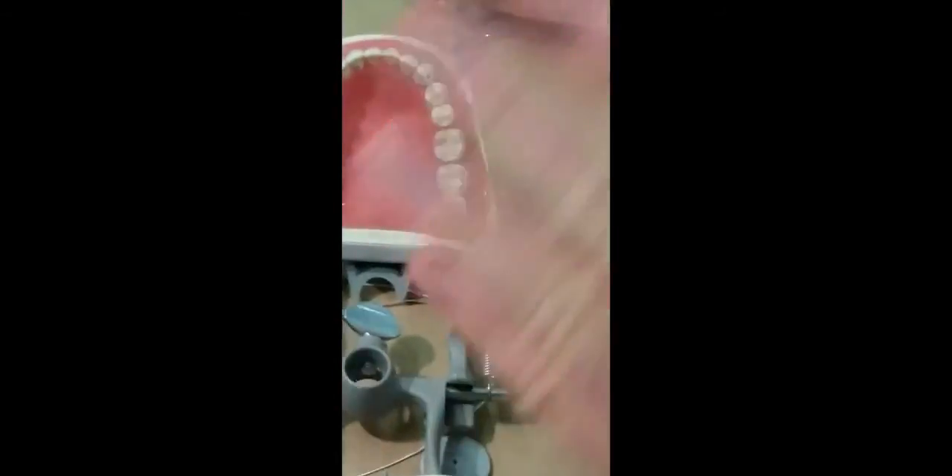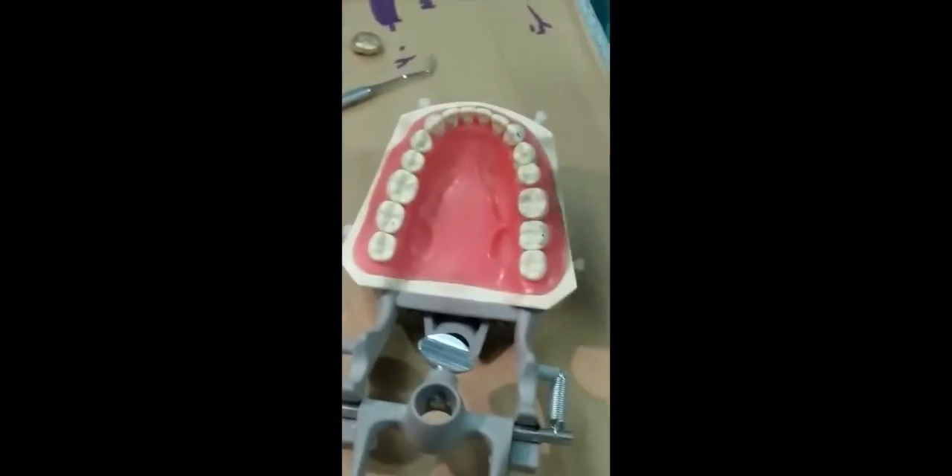If you got a little smear on an incline, that's what you adjust until you put the mylar in, go through the excursive movements, and get it to hold. You can also use the thin sheets of perforated occlusal indicator wax that's available for this.